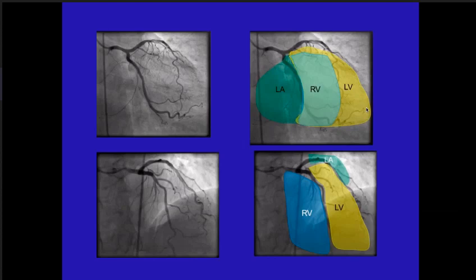Posterior to LA, sir, because that right AV groove will be running on that side. So we won't be able to see it on first view. Not exactly. See, the RA will be lying plumb in front of LA here. You cannot mark RA now because it will be lying on this. Here, exactly. You will see the atrial septum en face, also called the frontal view or the en face view of the atrial septum. The RA and LA will be lying one behind the other. So if I have to draw RA, I will draw it exactly on top of LA.